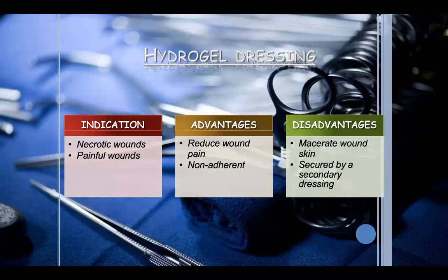Hydrogel dressing, where they are applied, the indications: necrotic wounds, dirty wounds, and painful wounds. Advantages: reduces wound pain, not adherent.